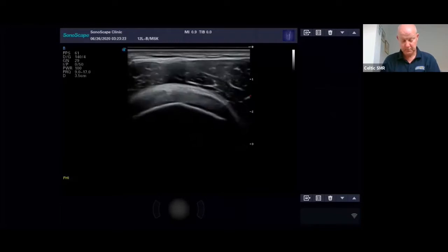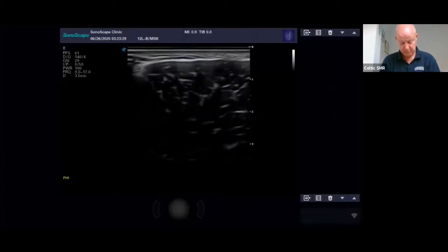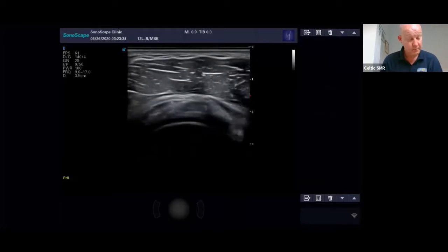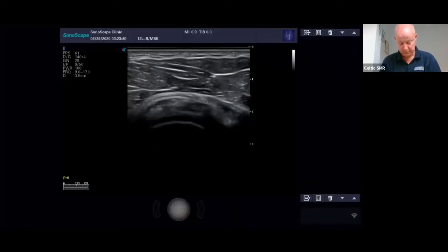So if you look at Abid's here, where's my deck? There it is. It's got a little bit of thickening to the bursal surface. So what I'm doing here is I'm optimizing my image to look at this bursal surface. This isn't optimized, this is all dark and it doesn't look right, so I'm not worried about that at the moment. I'm interrogating this. You have to optimize the image to the area that you're looking at. So I've got my focus here, and I've optimized it to look at this bursal surface, and there's a little bit of fluid in here, a little bit thickened.